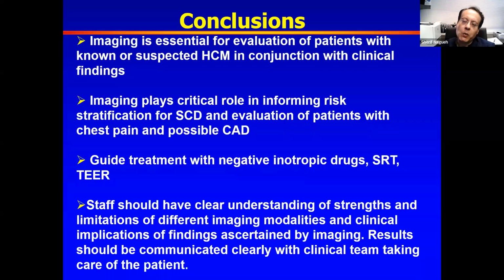In our lab, we have a QA piece where we look at patients who have undergone both echo and CMR within 1 to 3 months, and we compare these studies as far as ventricular volumes and ejection fractions. And that has been a very valuable tool. I will submit to you, most physicians actually do not measure biplane ejection fractions. They go by dimensions. And if you were to measure volumes, you will discover that the ventricles are larger than what you think. And that could be helpful in recognizing patients with a significant degree of mitral regurgitation.